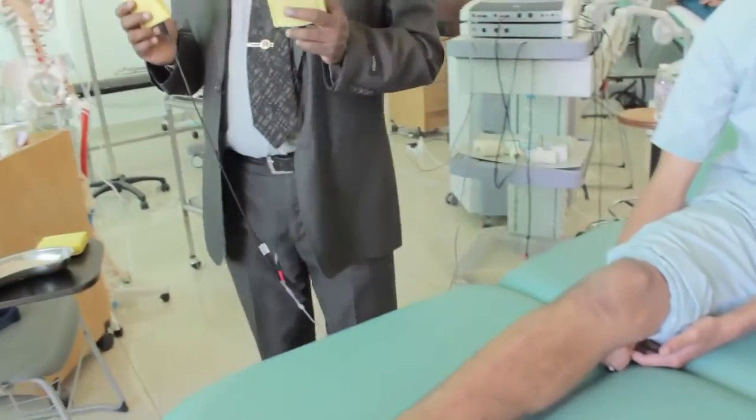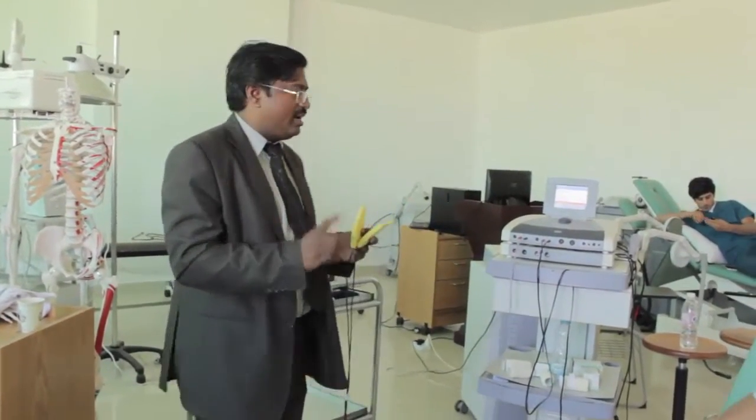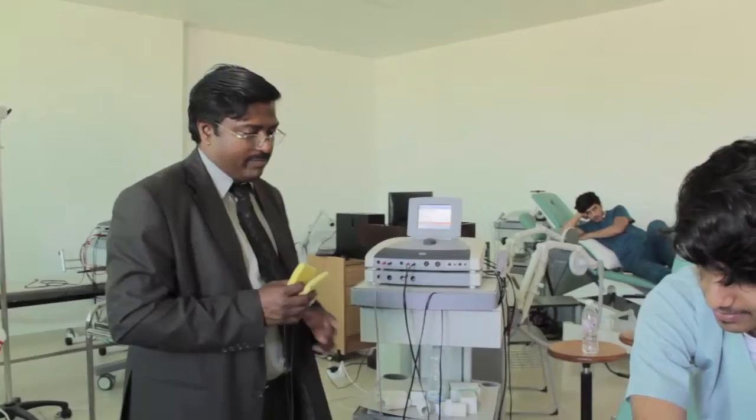So when you stimulate dorsiflexors, follow all the procedures: communication, ruling out contraindications, indications, collecting the apparatus. The materials are the same. What materials you require for high voltage pulsed galvanic current and for Russian currents are the same. It is not going to change much. Only the big change is the placement of the electrodes and the settings in the machine.